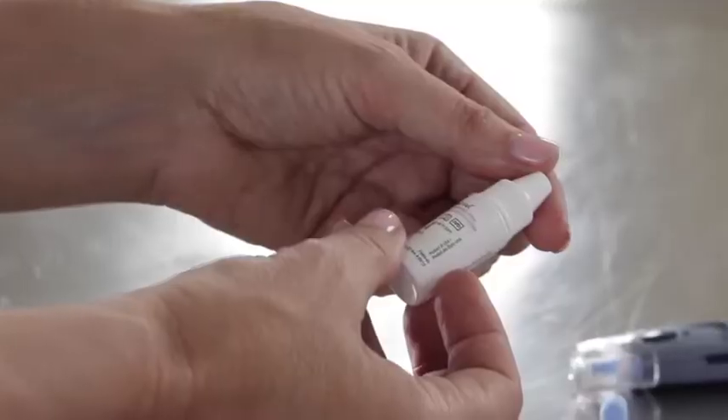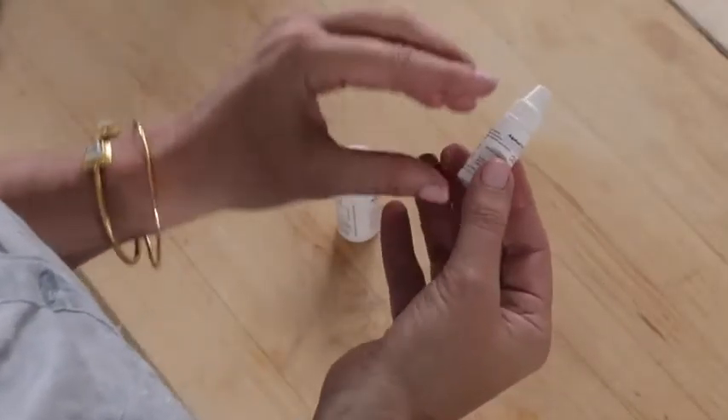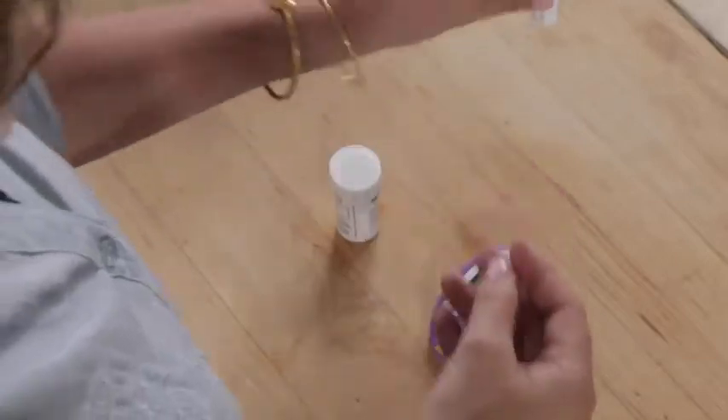Once the meter is set up, you'll need to perform an AlphaTrak control solution test. The control solution test should be done when you first buy your AlphaTrak starter kit, every time you buy new strips, or when you're questioning the accuracy of the reading. The control solution is a red liquid containing a fixed amount of glucose. It's a good way to practice and to make sure the meter and test strips are working together properly. To begin, check the solution's expiration date and be sure to throw it away three months after the first use.